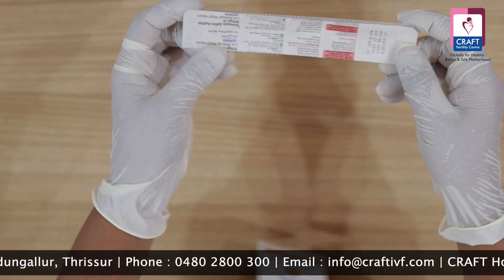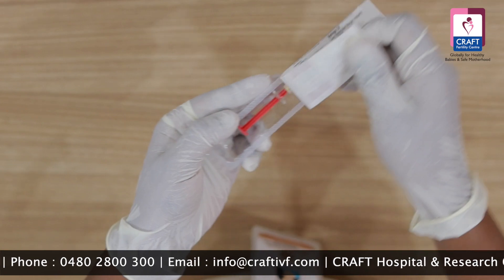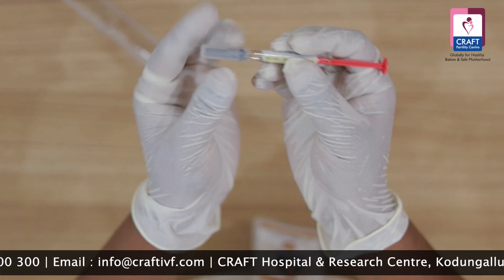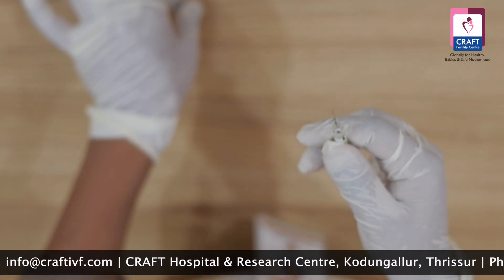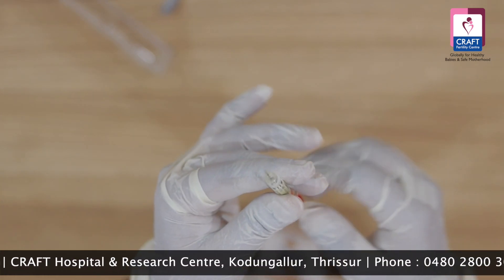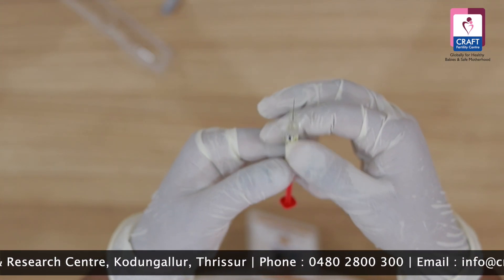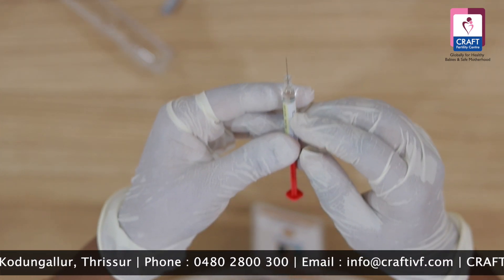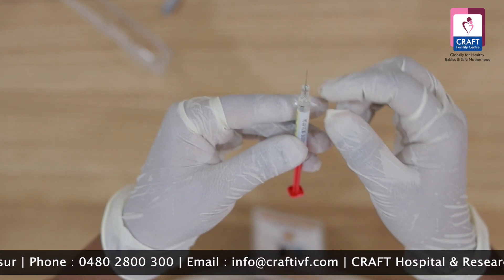This is a pre-filled injection. Pre-filled injection is pre-packed — this is our medicine. The needle is attached to the cap. This is a pre-filled subcutaneous injection. Check for backflow.